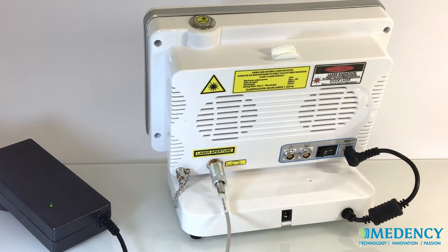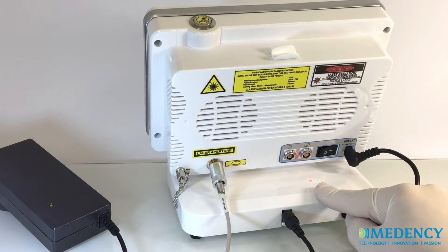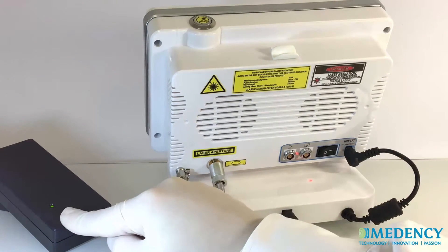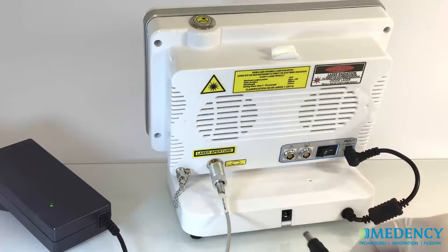Primo will operate using either DC power or rechargeable lithium-ion battery. To use DC power, connect the power cord to the laser console and plug it into a wall outlet. To use battery power, fully charge the battery first by plugging in the power supply and turning the laser console on at the power switch. Once the battery is charged, unplug the power cord from the wall outlet and the laser console. The laser console will then run on battery power alone.